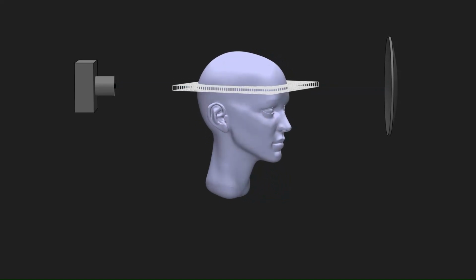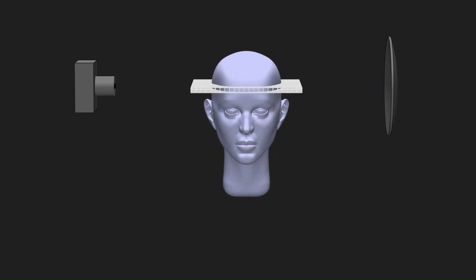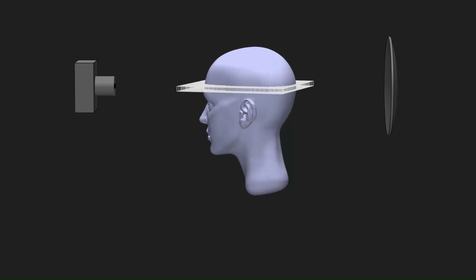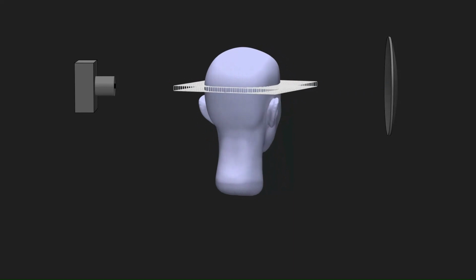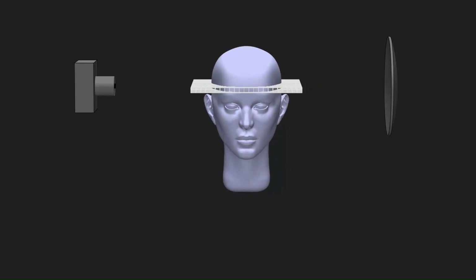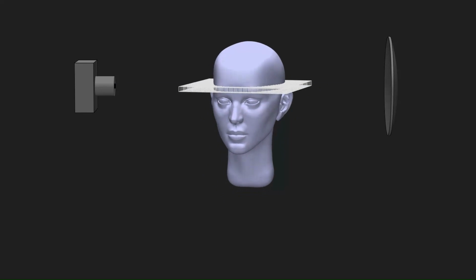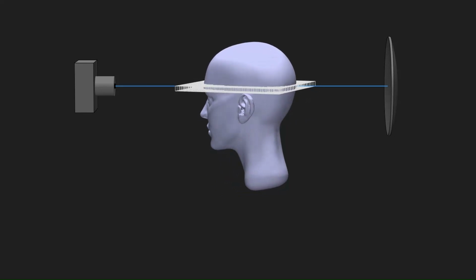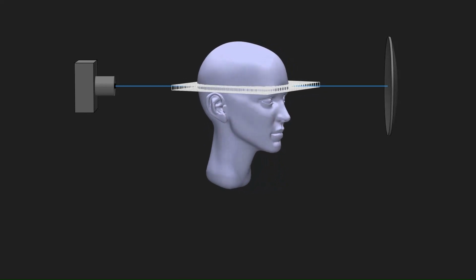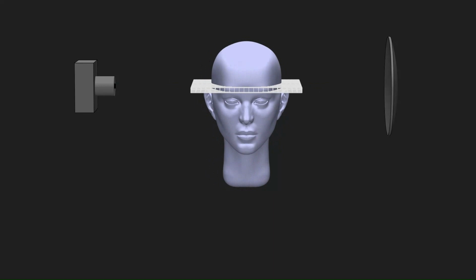This pattern will ensure that an equal number of protons pass through each little cube of the grid. Each scan will have uniform clarity and a consistent level of detail. As with any medical imaging method, it is important to limit the patient's exposure to the imaging radiation, which our beam pattern achieves.